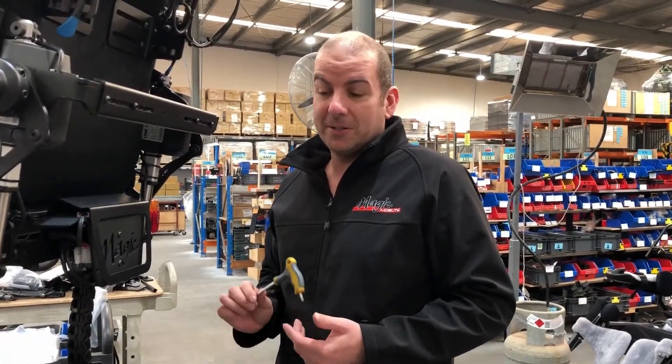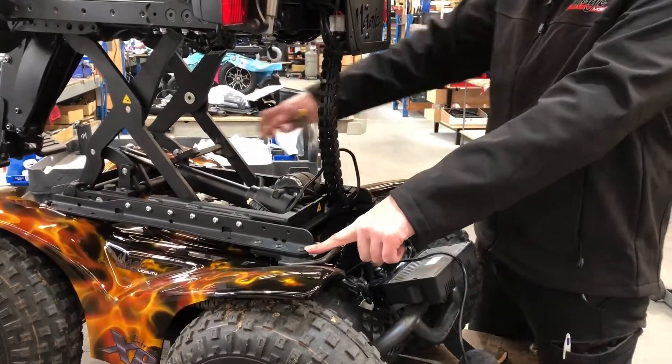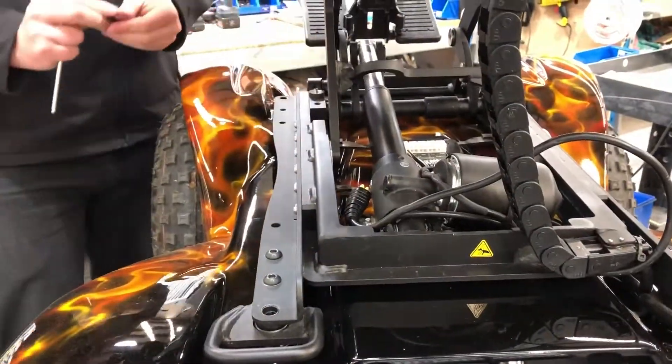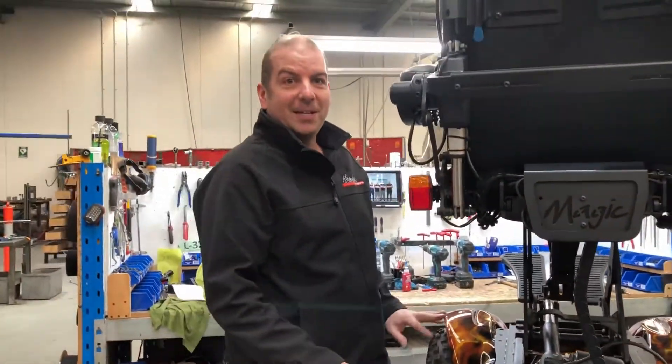The next step is to undo the four bolts holding the seat unit onto the chassis, which are the bolts in the furthest corners front and rear. And that's it — the seat is now ready to lift off, so we'll get a few helpers for that next step.